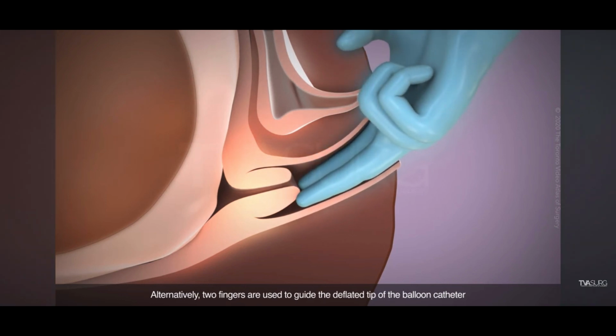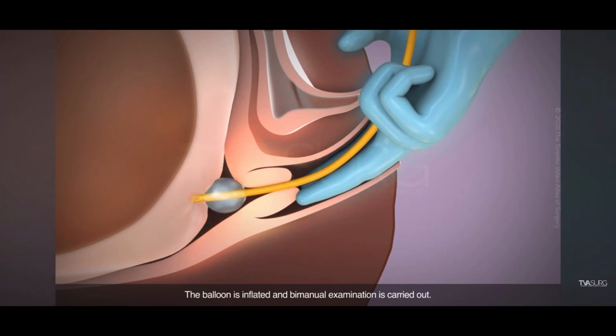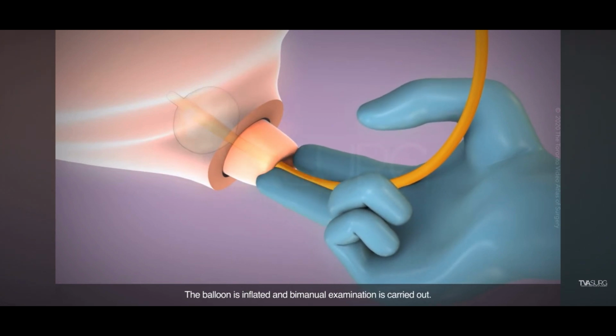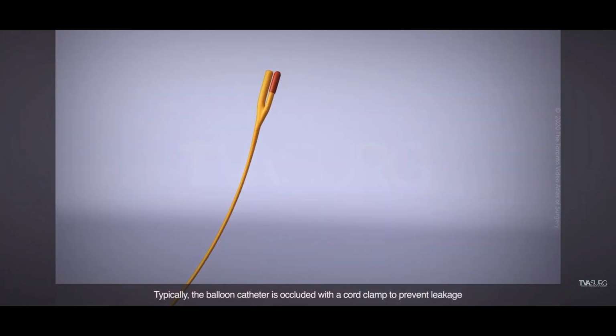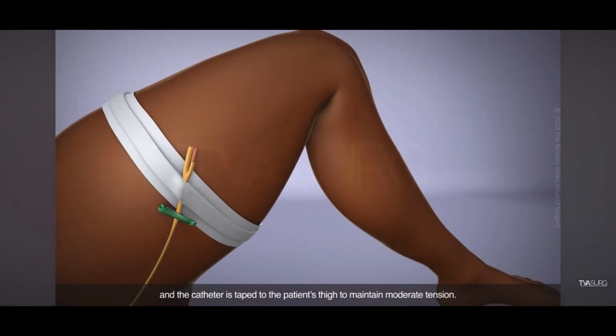Alternatively, 2 fingers are used to guide the deflated tip of the balloon catheter through the internal os. The balloon is inflated, and bimanual examination is carried out. This technique can be easier when the cervix is slightly dilated. Typically, the balloon catheter is occluded with a cord clamp to prevent leakage, and the catheter is taped to the patient's thigh to maintain moderate tension.